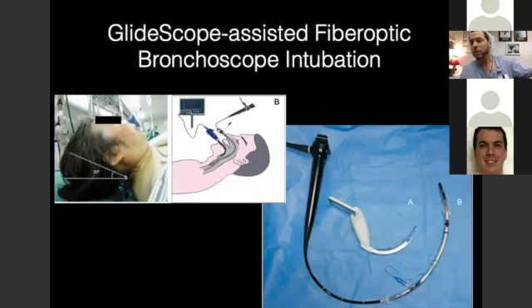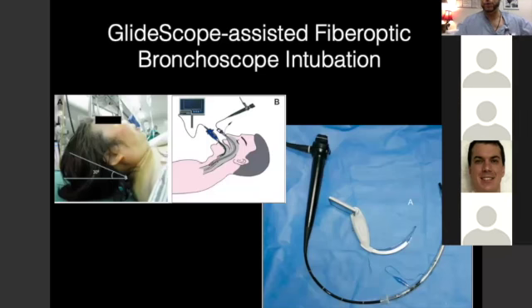You want your end tidal on the screen to go from a respiratory rate of, say, 14 down to maybe 8 to 10 or 6. Whatever it is, the lower the respiratory rate, the more likely you'll be able to not have gagging, and they'll tolerate the intubation. So we'd start our remifentanil at 0.05 mics per kilo per minute.